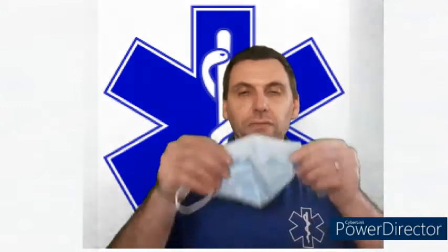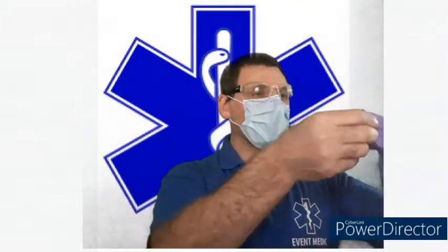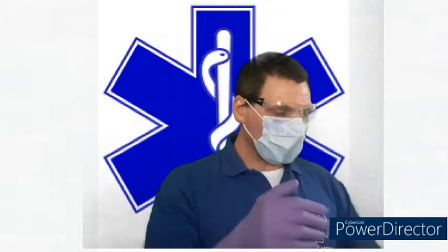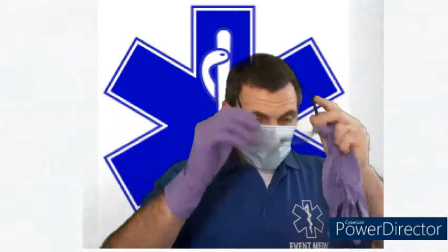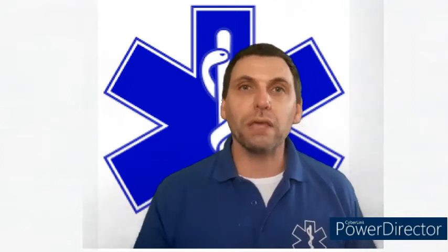With any airway manoeuvres, we should always have the appropriate PPE on. So we should consider having a mask, goggles, and gloves because of the potential of bodily fluids in the airway. Just as a reminder, at the moment, in the pandemic, we should be wearing level 3 PPE as per government and local guidelines for all airway manoeuvres. So this video is not going to be wearing that level of PPE.